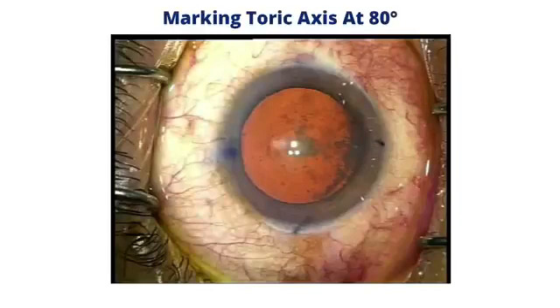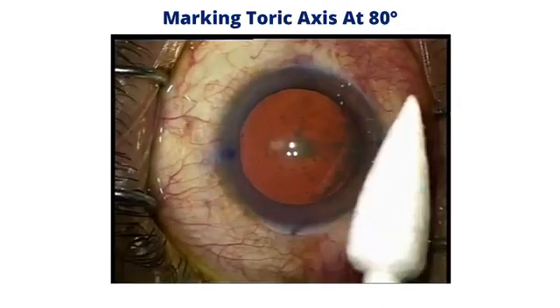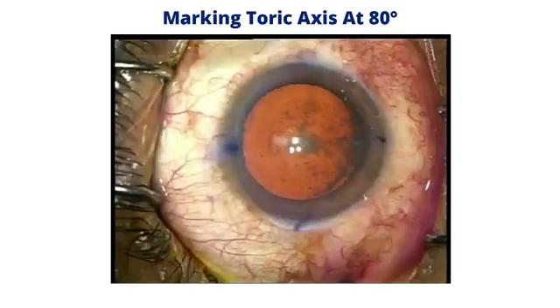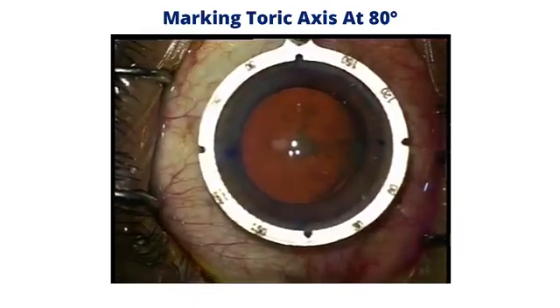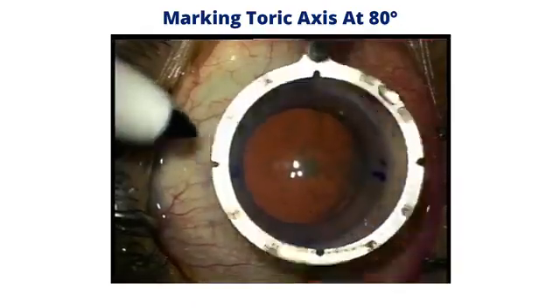And I'm just going to share with you how we do the toric axis marking when the patient is lying on the table intraoperatively. So I'm planning to mark at 80 degrees, and you can see my 4 marks already very clearly. I dry the eye, and then I'm just marking at 80 degrees with that toric ring alignment.